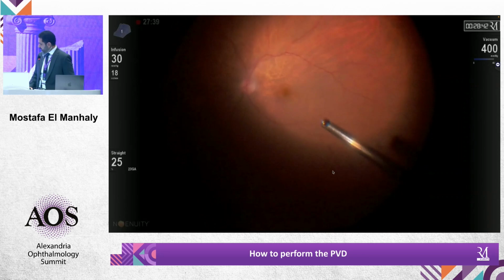So once you have vacuum inside the eye, you'll get some vitreous with the hyaloid entangled in the probe once you don't have nucleus. So the issue of traction transmitted to the rest of the retina is very high if you leave vitreous and try to go. So I treat a dropped nucleus as an intraocular foreign body. With foreign bodies, I remove the vitreous and deal with it.